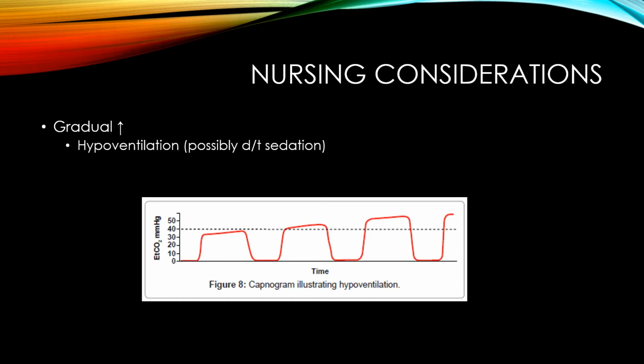Look for inadequate expiratory time, a malfunctioning inspiratory valve, other malfunctions in the breathing circuit, or insufficient inspiratory flow rate. We want to make sure that this is not a mechanical issue also. But of course, always look at your client and assess them and see how they are doing. But again, you will see this type of waveform with hypoventilation.